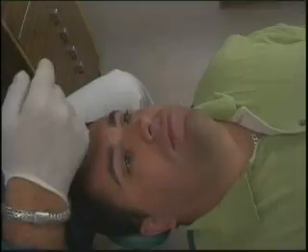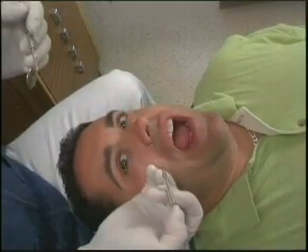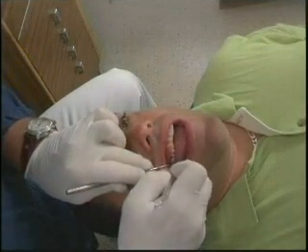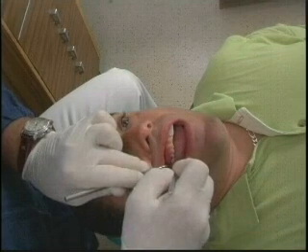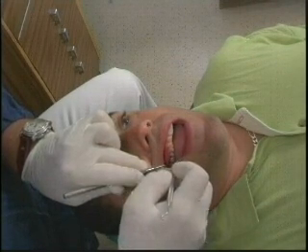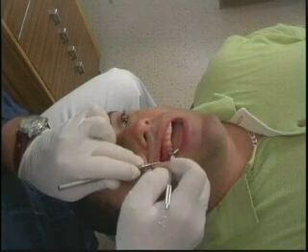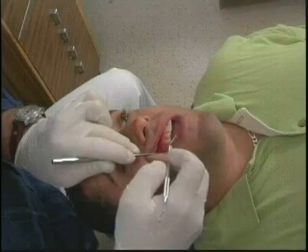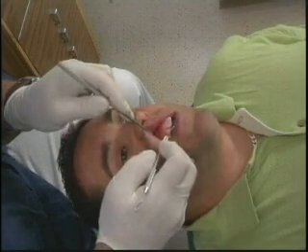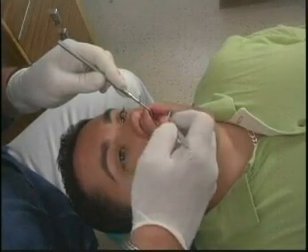Then what we would do is we would take the little probe here, which again is just measured in millimeters, and we would go ahead and start in the back, and we would measure 5, 4, 7, 7, 4, 5, 5, 4, 3, 3, 3, 3, 3, 3, 3, and measure all the way around to try and find out how far underneath the gum tissue we can get the probe, because that gives me an idea of where the bone level is.